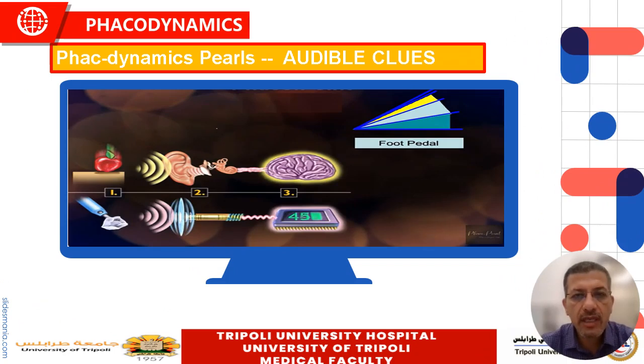Before I finish this lecture, I would like to speak about the audible clues. You know, phacoemulsification is an art in which the surgeon uses all his senses at the same time. So he uses the right foot on the foot pedal of the phaco machine and the left foot on the foot pedal of the microscope, and also the right hand using the phaco handpiece and the left hand for the second instrument, the chopper or the Sinskey hook.